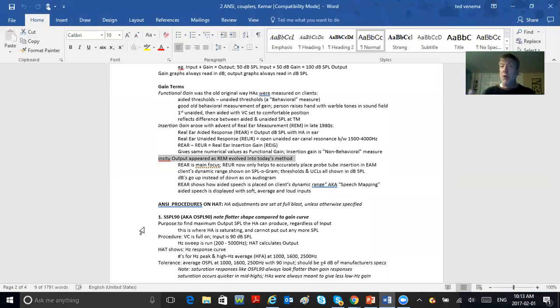Output is the groceries that are delivered to the doorstep of your eardrum. Gain is just, how did I get that output? I need to make sure that the output SPL is audible to me. I have to make sure that the aided output SPL, if that's speech, is that speech audible to me?